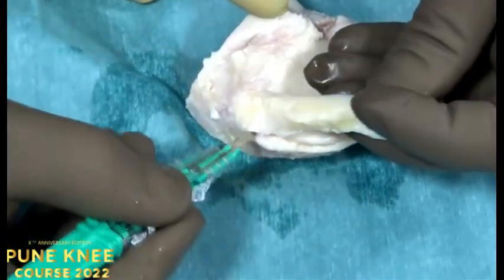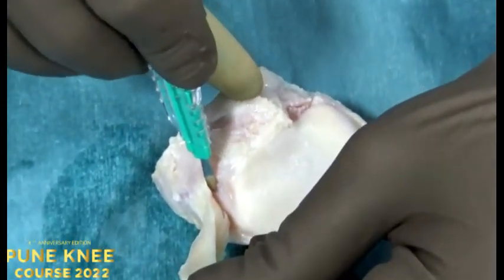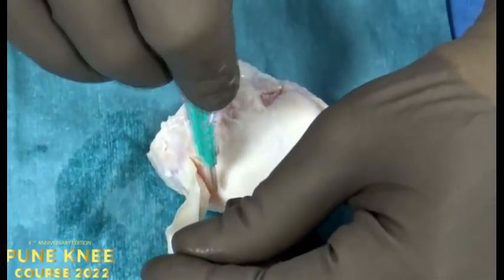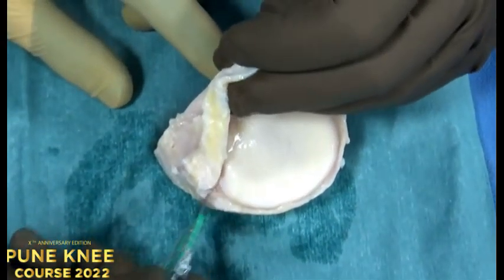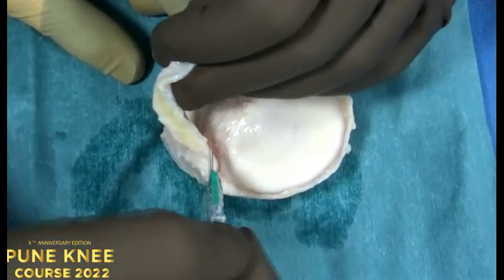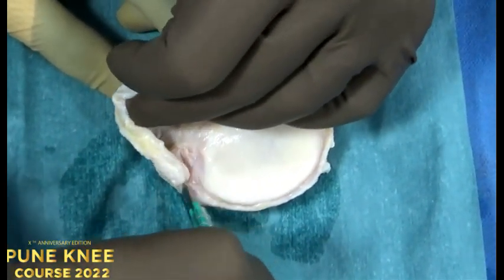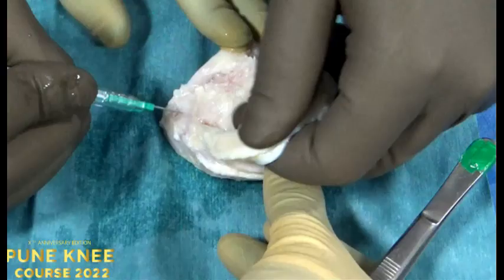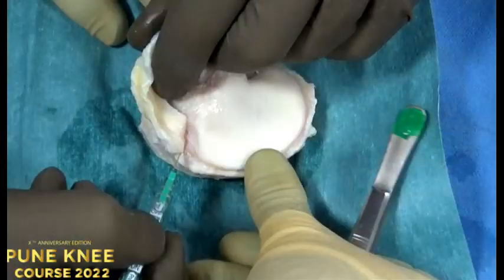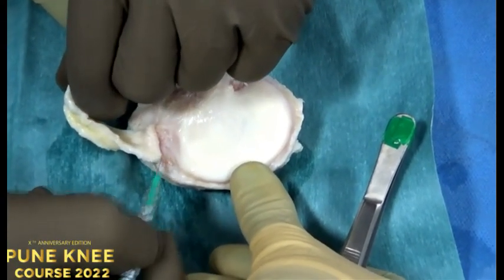In the anterior horn it is easier because, in this case, it didn't come with the intermeniscal ligament, but still you have a lot of insertion that goes to the tibia, as you're observing there. You can speed up the video if you want. Okay, it's fine. So you're finishing there.